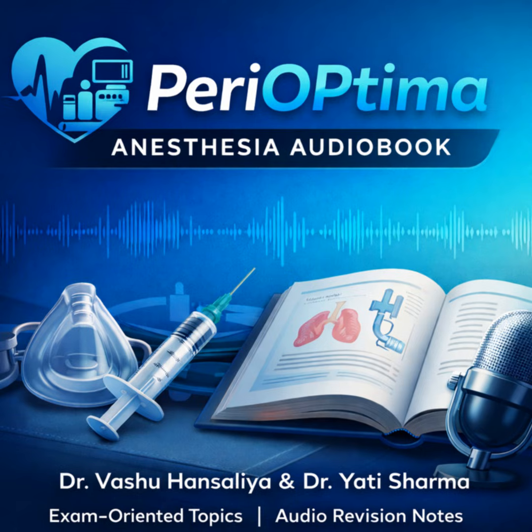O2 Flowmeter position. The downstream rightmost position of the O2 Flowmeter ensures the integrity of the minimum FiO2 against any upstream leaks. The O2 flush risk. The O2 flush delivers a massive 35 to 75 liters per minute flow, which, if misused, poses a severe risk of barotrauma, especially in patients with low lung compliance. Vaporizer safety. Agent-specific filling systems and mechanical interlocks prevent chemical cross-contamination and the dangerous delivery of multiple volatile agents at the same time. Desflurane specifics.